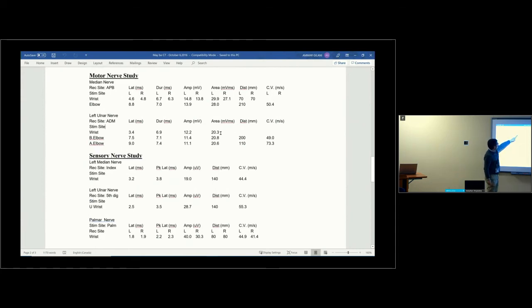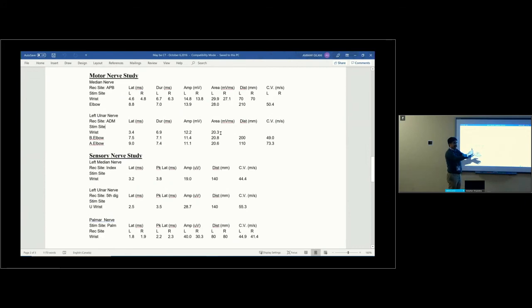So in this patient's case, the distal latencies we talked about, 4 is normal for carpal tunnel, for median nerve. It's more than 4, so these are prolonged. Amplitudes are normal at 5 or more, so they were normal. Conduction velocity is normal at 49 or more. So the only thing we've seen is that the distal segment of the nerve shows prolongation on motor nerve conduction studies. The ulnar nerve was normal. Conduction velocity is okay across the elbow. Amplitude is 6 for this nerve, normal. And latency is less than 3.5. That's normal.